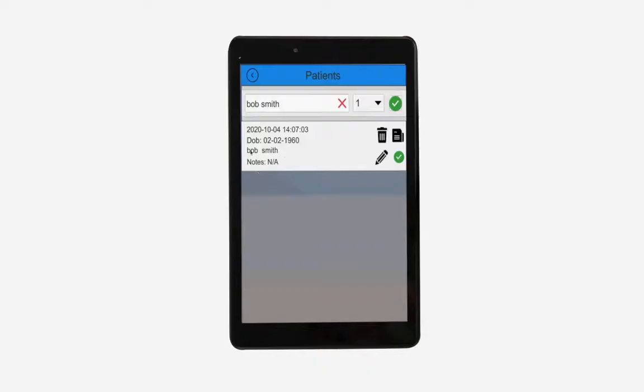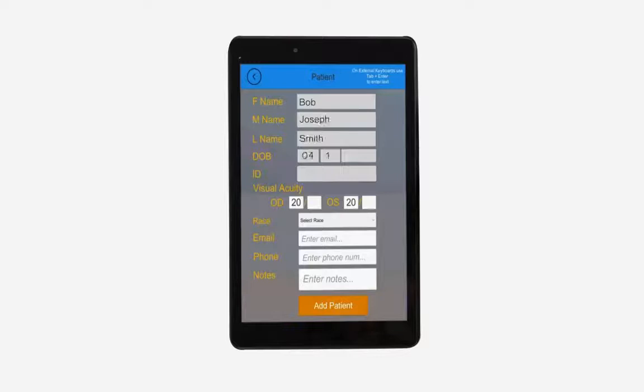To get started, select the patient from the database. To set up a new patient, click new patient and enter their information into the required fields.